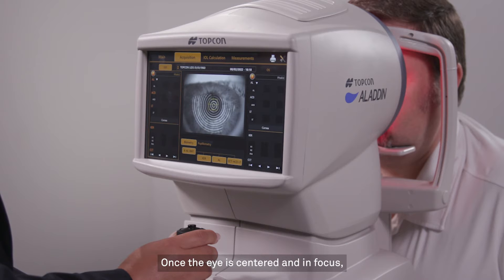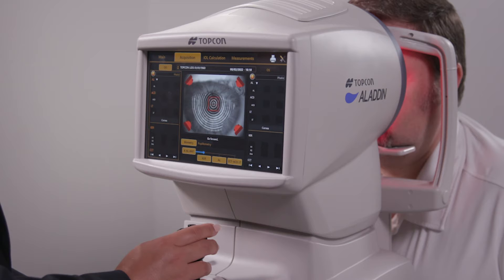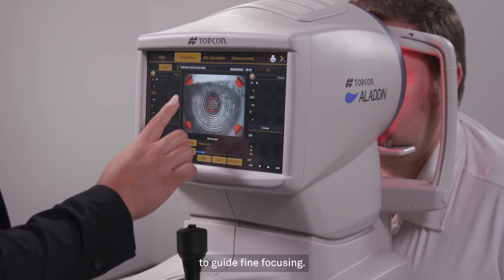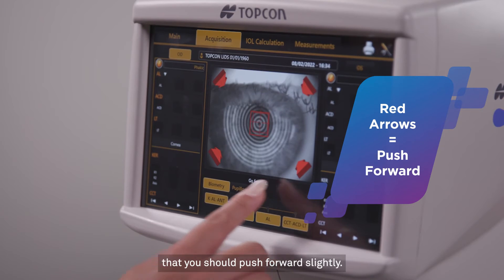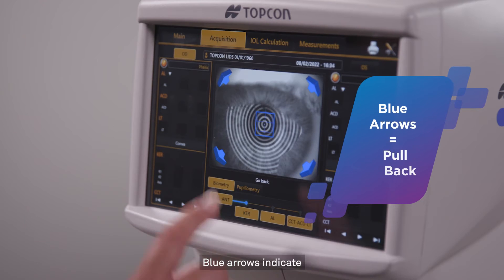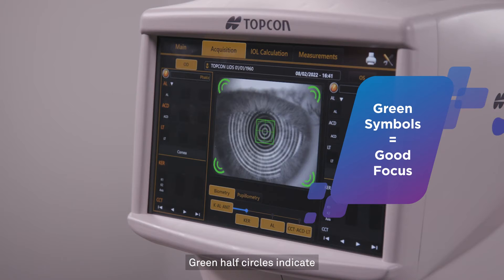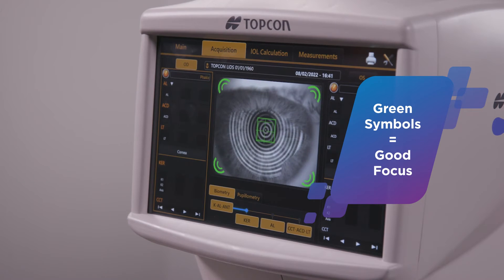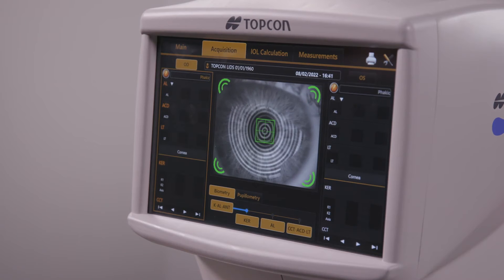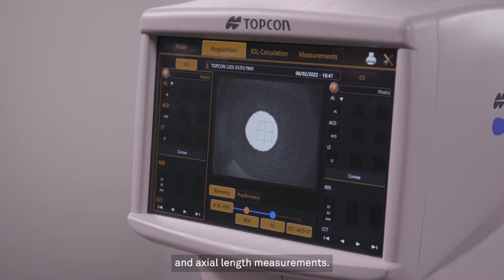Once the eye is centered and in focus, push the button on top of the joystick once. Symbols will appear in the four corners to guide fine focusing. Red arrows indicate that you should push forward slightly. Blue arrows indicate that you should pull back slightly. Green half circles indicate that the focus is just right. Have the patient blink once and then open wide.